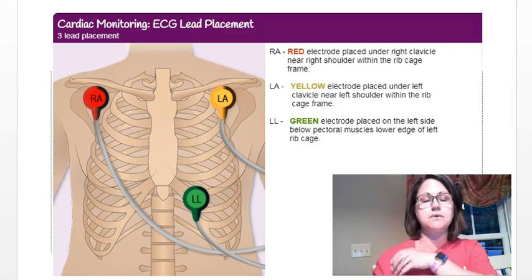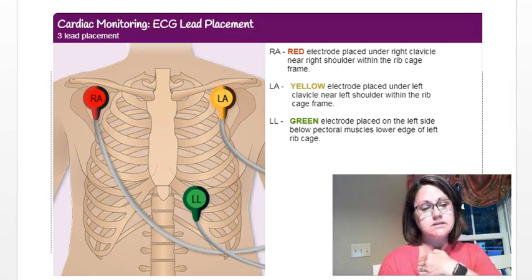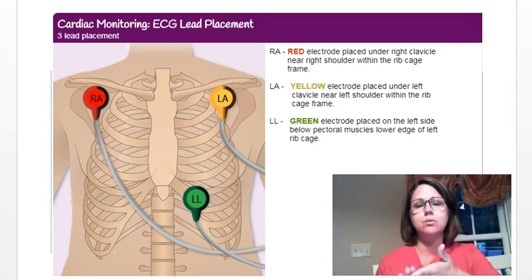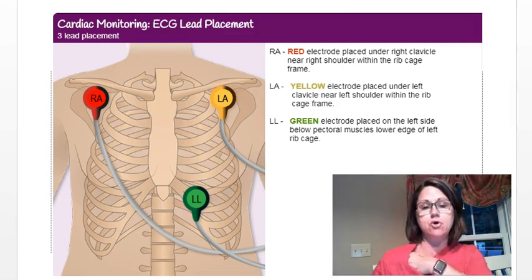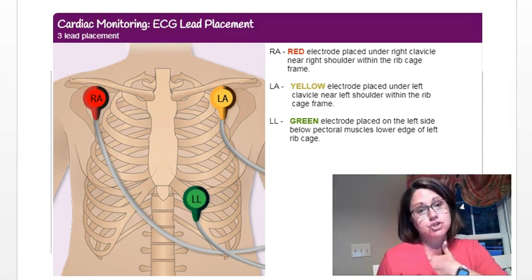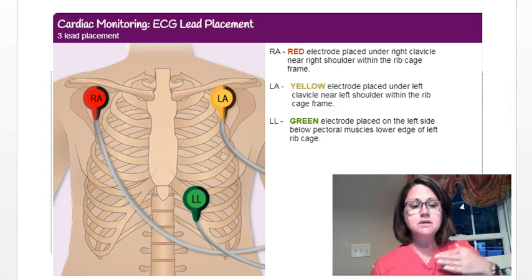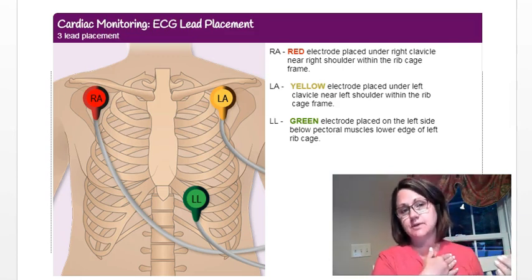You don't want it on the clavicle or on your rib — place it right in the middle in that soft area. It's not a precise science; you can move it a little further out or closer in. The key is a good connection, so avoid placing it on a hairy surface. If you have a hairy chest, move out to a less hairy area, or trim your chest hair if needed.